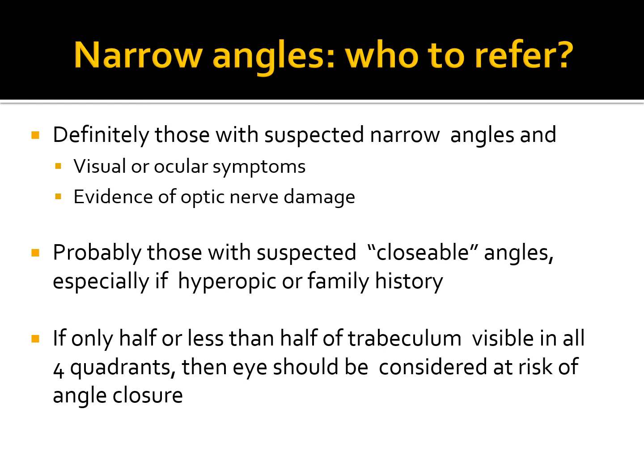The main thing that we can't do, in my opinion, is check for the pigmentation of the trabecular meshwork. But again, if you've done your full assessment anyway, and the pressures are somewhat high, and you open the pupil up and you realize that there's pseudo-exfoliation, or if there is pigmentary dispersion syndrome, then frankly, there's the evidence there in the anterior chamber without actually looking at the level of pigmentation evident in the trabecular meshwork.